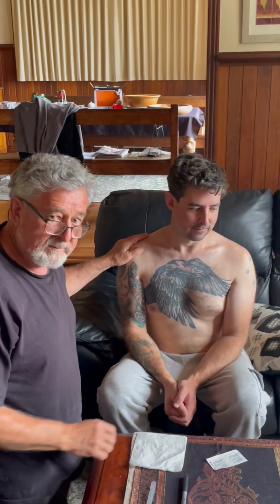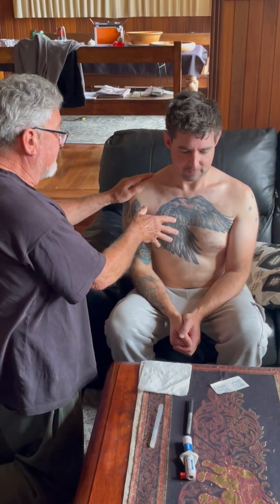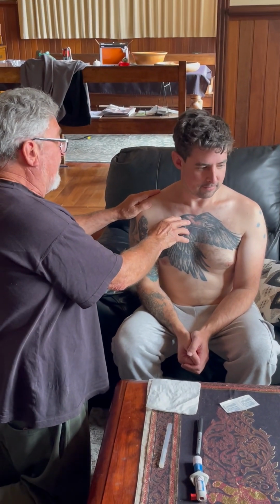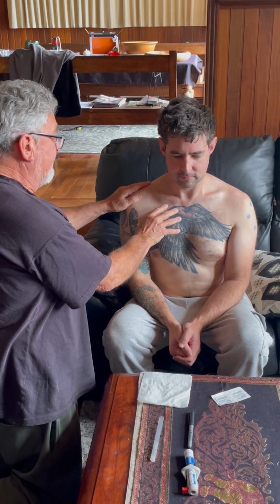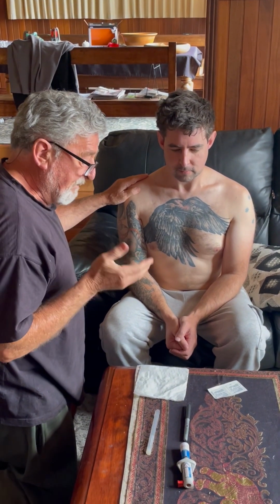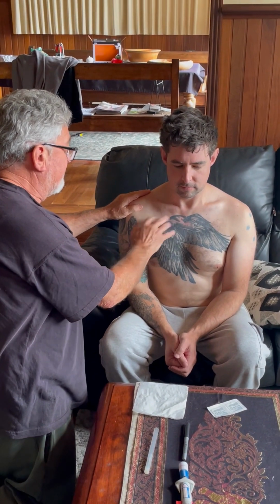Do an example of tension pneumothorax, needle decompression. We're using Luke here as an example. We're assuming he's got a tension pneumothorax, he's got all the signs: respiratory difficulty, this part of the chest is greater than the other side. It's all in my notes there, the various signs for tension.